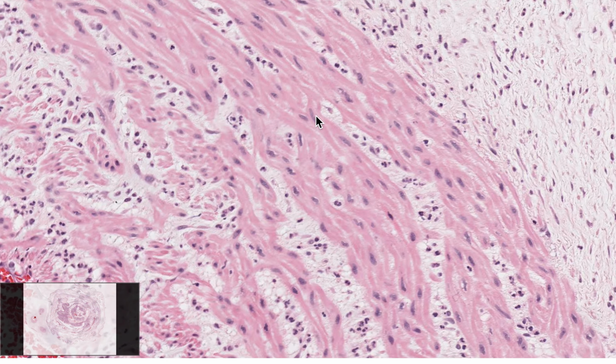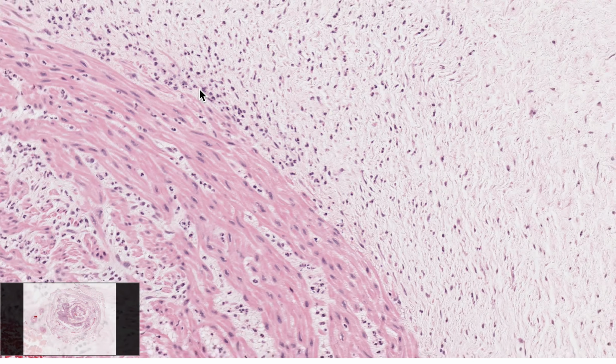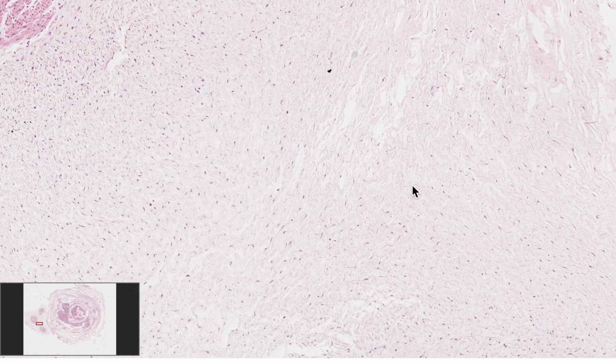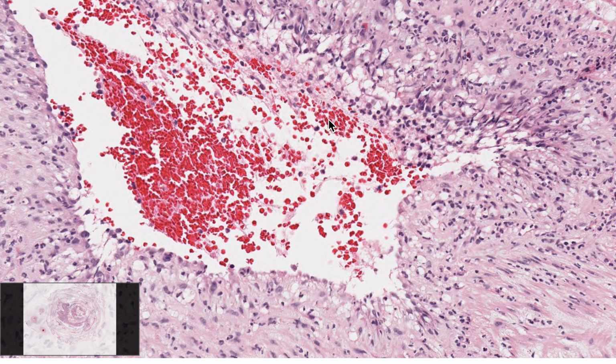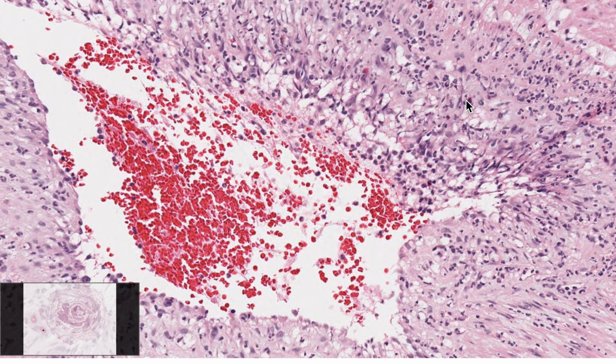Now, once the neutrophils traverse and journey on to what we call the Wharton's jelly, then it's called acute funisitis, which basically means it's a more serious infection. And let's see if the same thing applies here. So here's the umbilical artery, baby's blood, and we can see some neutrophils here.